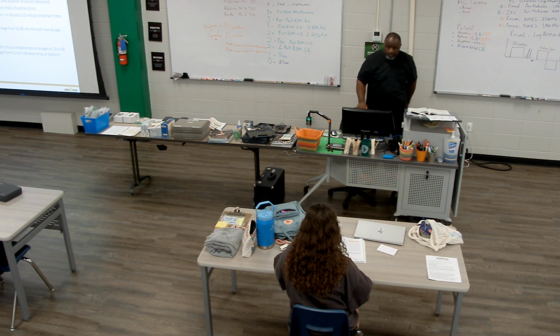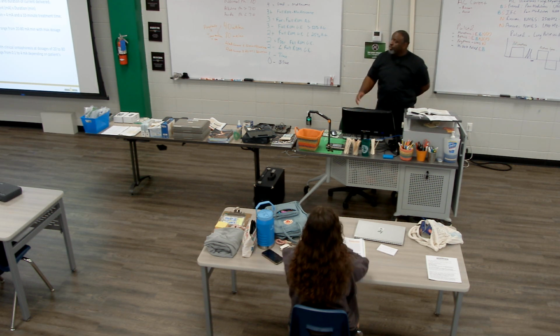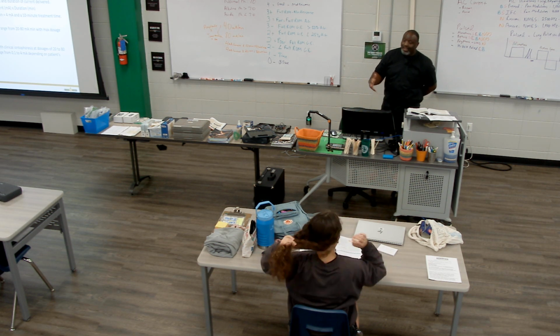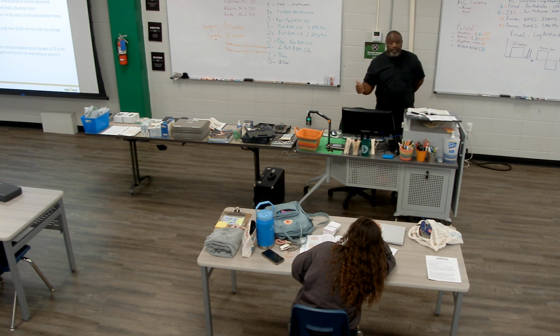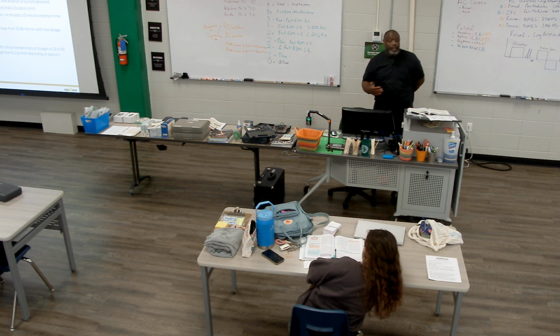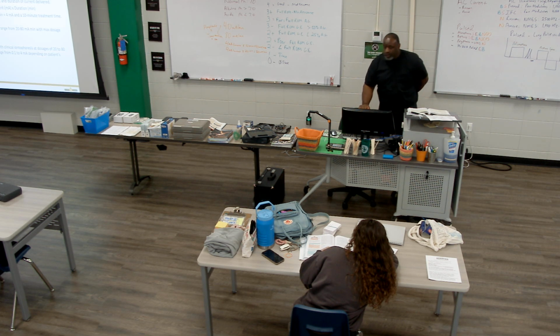Most times people will ask for dosages between 40 and 80 milliamp minutes, and you're trying to figure out how to get that done. If they can tolerate 4 milliamps, great, it only takes 10 minutes. If they can't tolerate but 1 milliamp, I'm going to tell them to have a seat and we'll let this run until we get our 40 milliamp minutes. It's going to take 40 minutes.